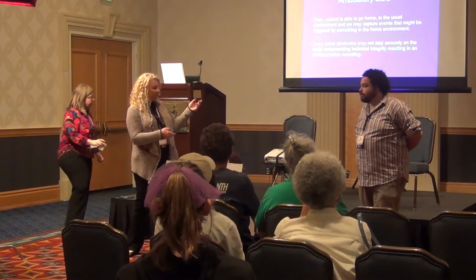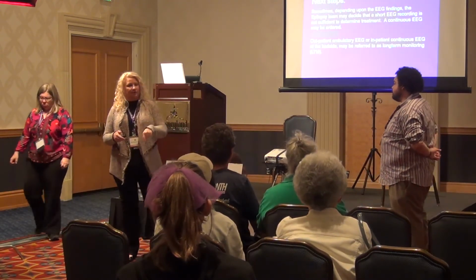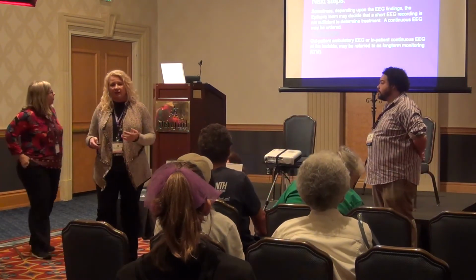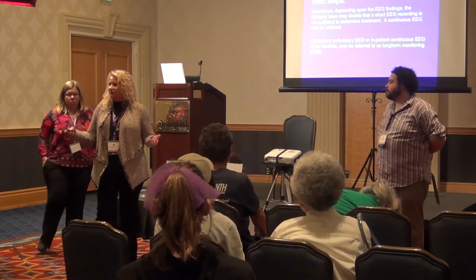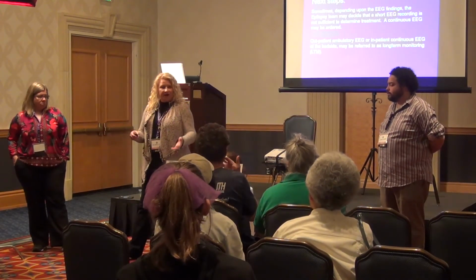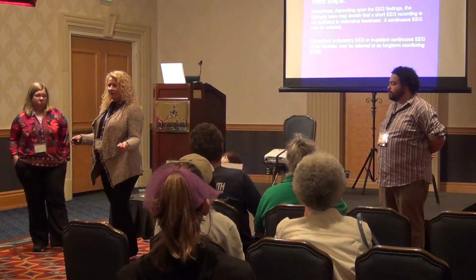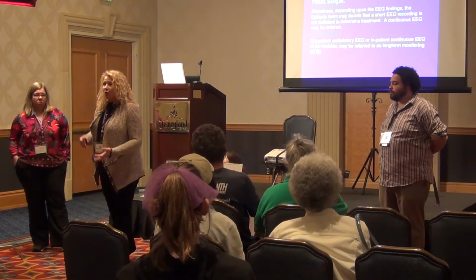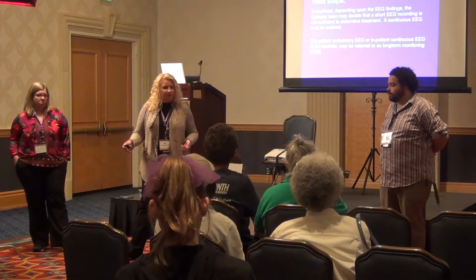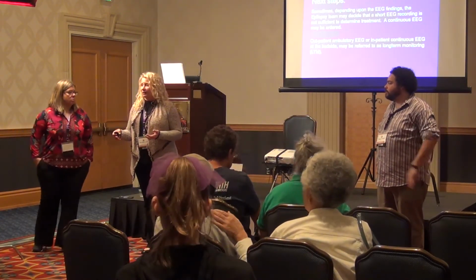So some of the things I'll go through before we start getting into who we are. It's just about the procedures. After having an EEG, what are the next steps? We'll have a physician look at the EEG, assess and say, okay, based on the findings, we would like to do this, or we'd like to have you do an ambulatory EEG, or we'd like to have you admitted to the hospital for long-term monitoring, or go into an epilepsy monitoring unit, an EMU.